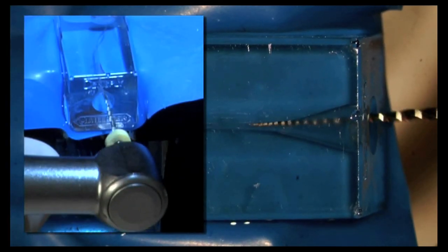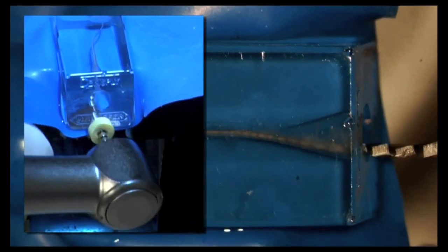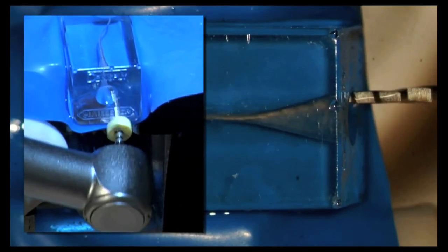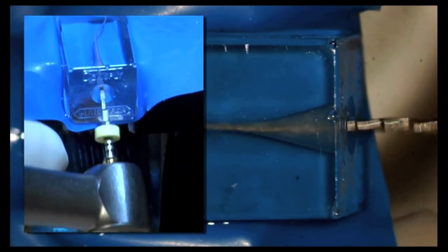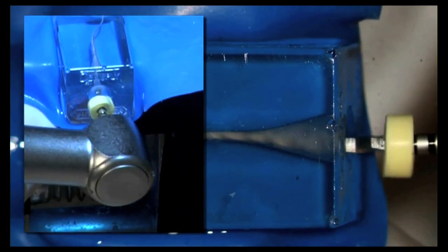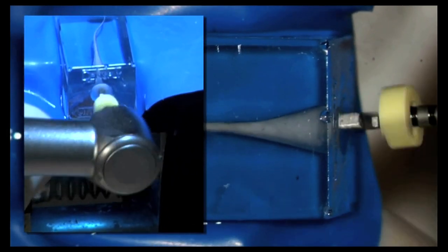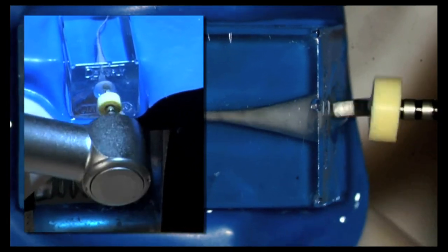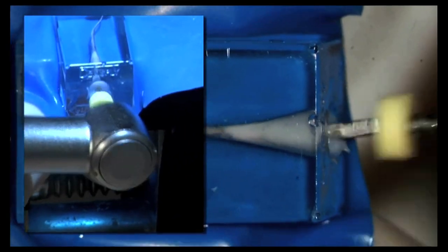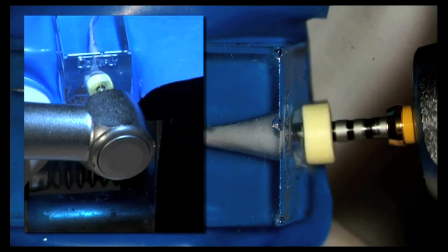In this video is an excellent illustration of the value of brushing and allowing the bigger geometries to move easily apically. That funnel at the top on the one on the right, and you can see it on the left as well, is our access cavity. You can see that first 3 or 4 millimeters, as the canal simply is brushed north, south, east, and west, but especially away from the furca, furcal danger as Cliff Ruddle would call it, and then just follow. Notice that the instrument, through brushing, allows the space for the instrument to follow easily deeper.